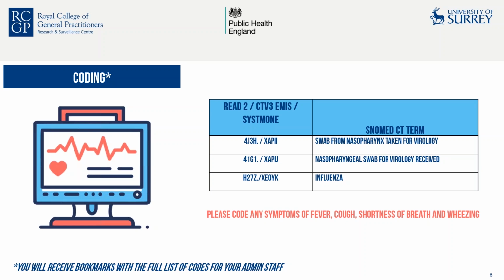So 4J3H into patient record every time you sample if you're an EMIS practice. Additionally, please code nasopharyngeal swab for virology received or 41G1 once you have received your results back from the lab. You will also need to code any results from the lab back into patient record, including any negative results. We do have, this is just some of the codes, a bookmark with all the codes that you might need in our welcome pack. Please note that the swab taken and received and results must be coded into patient record for payment, as we can't claim funding from our funders for any uncoded samples.